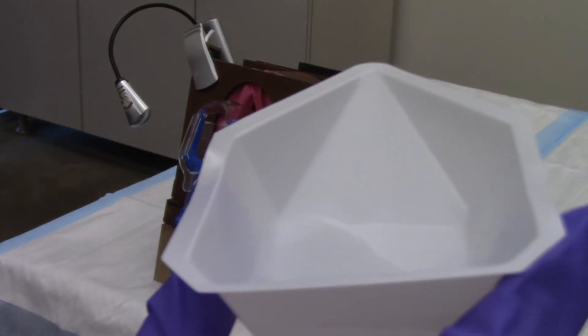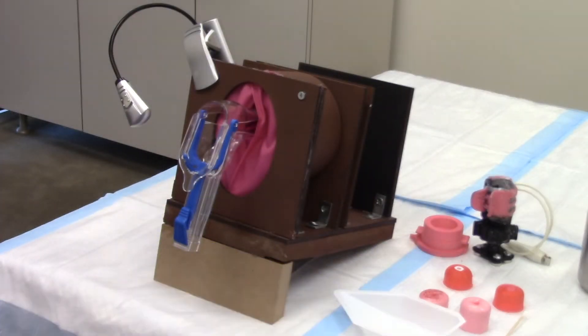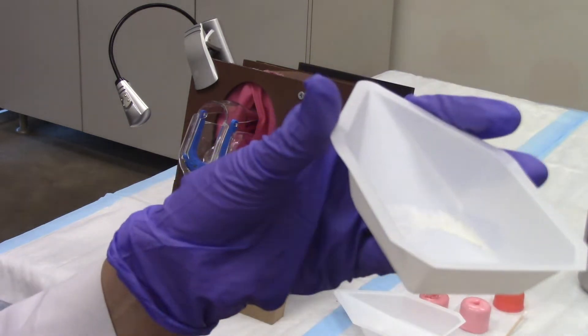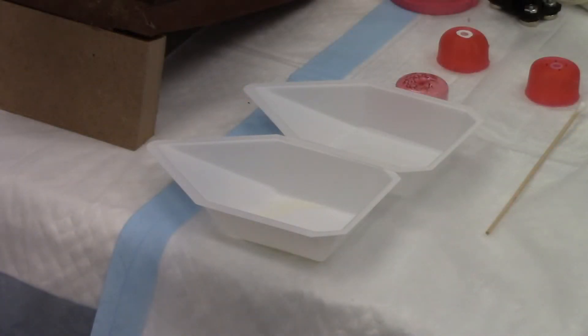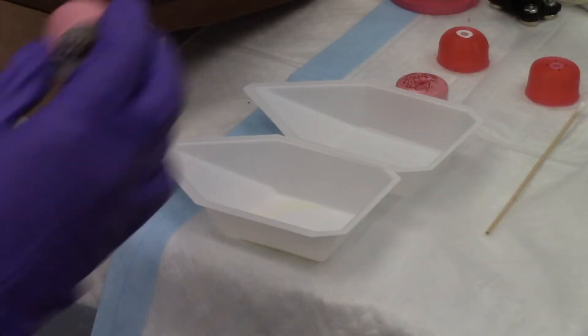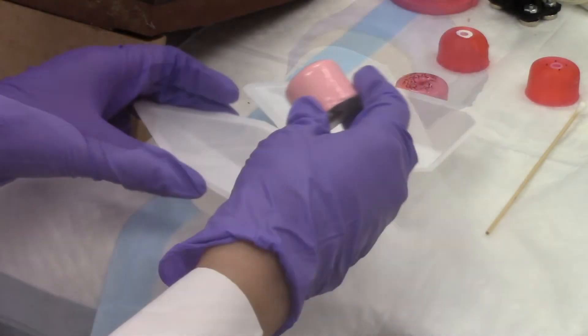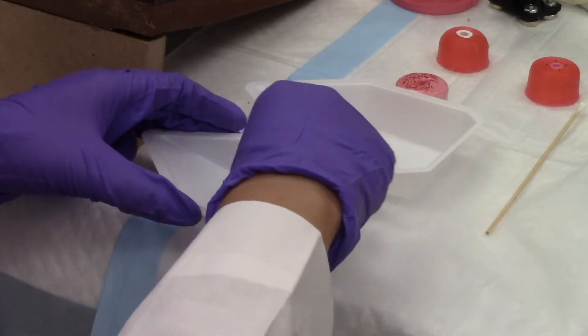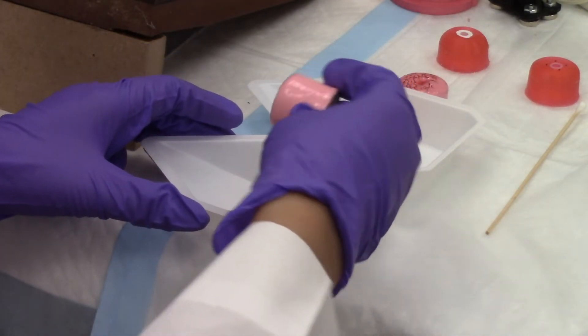To practice taking cervical swabs or endocervical samples, you can use water and corn flour. Take one of the 3D printed cervical models with an open endocervical canal and dip it in water, then dip the model in corn flour, making sure the flour covers the surface of the model and enters the endocervical canal.